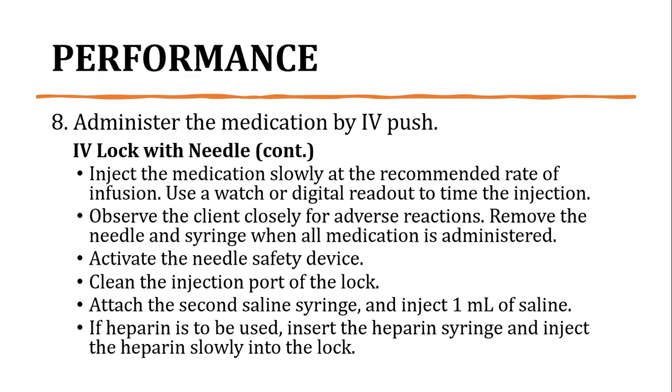Kailangan po nating sunodin yung recommended rate of infusion niya based sa kind of drug and the effects on the client. Then, observe the client closely for adverse reactions. Remove the needle and syringe when all medication is administered.